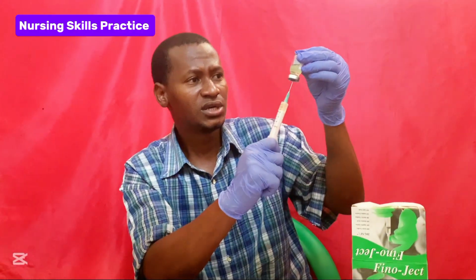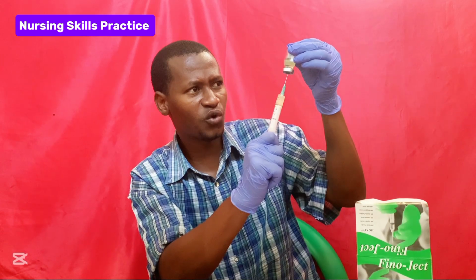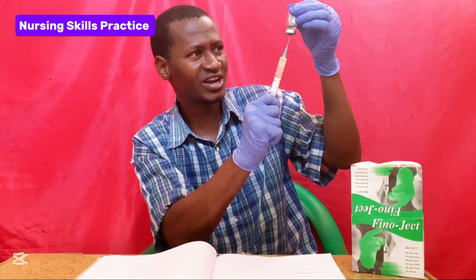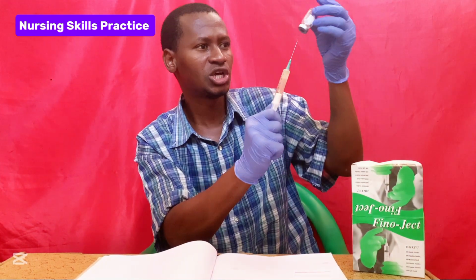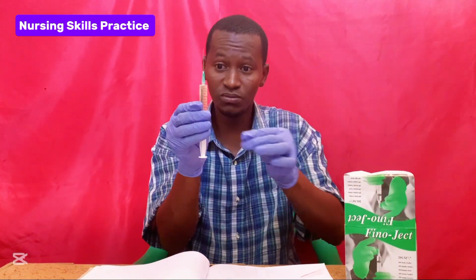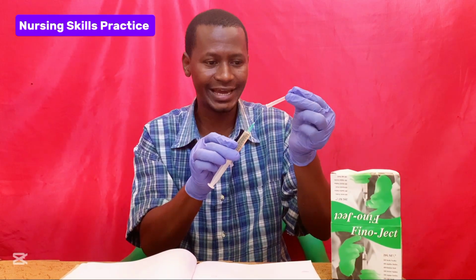Then you have to keep the needle in line with the drug to avoid air bubbles rushing into the syringe. So withdraw all the drug from the vial. Then when you finish, make sure first you remove air bubbles from the syringe. Ensure that you remove any air bubble. Then put back the cap of the needle.